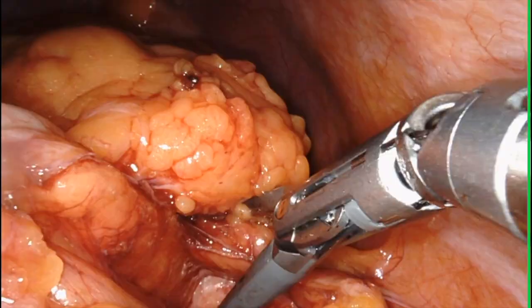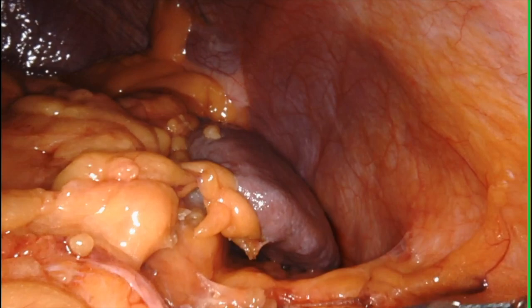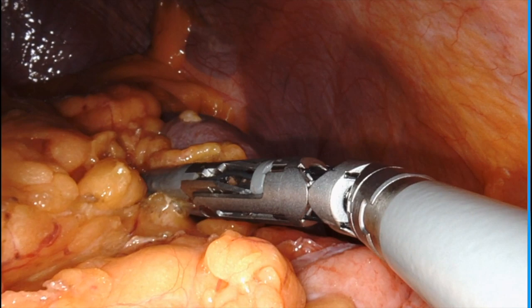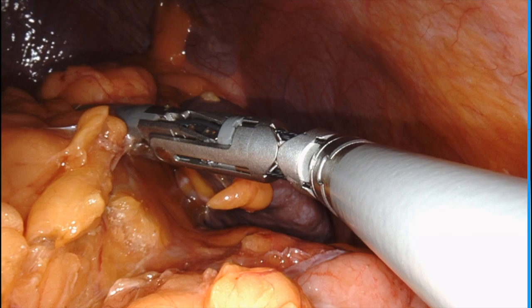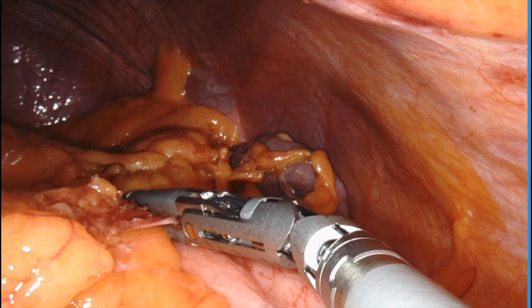I'm going to follow this lateral dissection all the way up until I meet the spleen. This patient had something called Morgenstern's criminal ligament — an attachment from the splenic flexure to the spleen that makes it more likely to have tears and bleeding. So I really took my time dealing with this attachment before carrying on with the takedown of the splenic flexure.